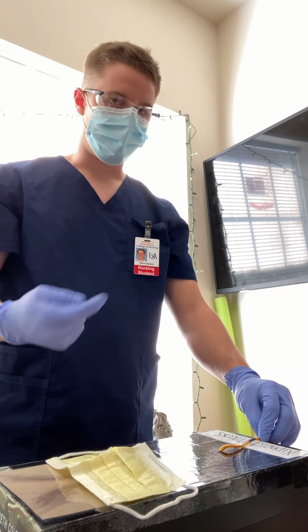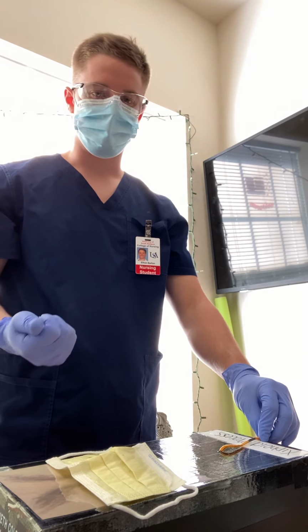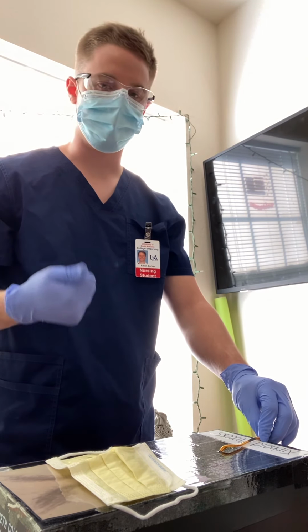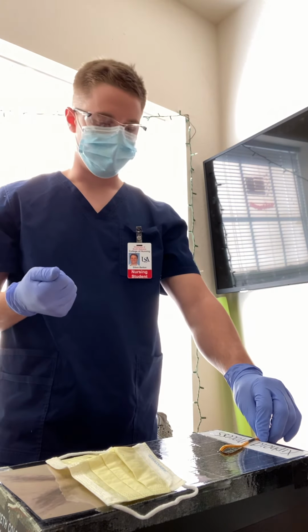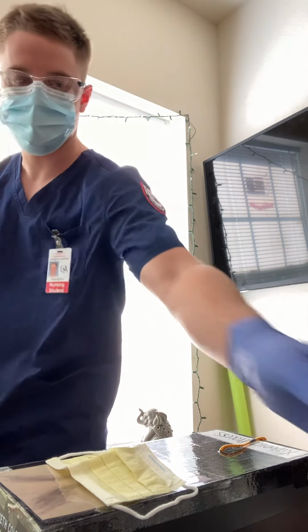I'm looking for any signs and symptoms of complications. And also, if I needed to obtain a culture, if there was any exudate seen, which is a sign of infection, if I need a culture, I'll then obtain that now. So after that has been done, I'm going to dispose of this dressing in my gloves, downwards towards the trash can. I'm going to move the camera so you can see.